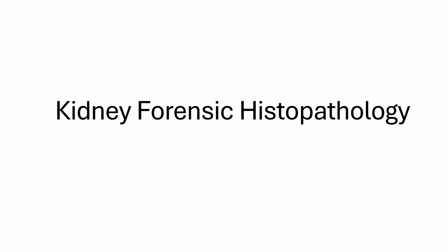Today we'll see about kidney forensic histopathology. So this single video is useful for all the 3 years, that is the first year for anatomy and histology part, and second year for pathology part, and third year for forensic histopathology. So let's move on to the session.